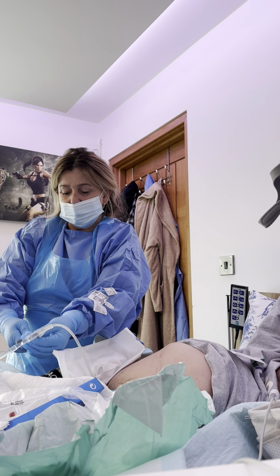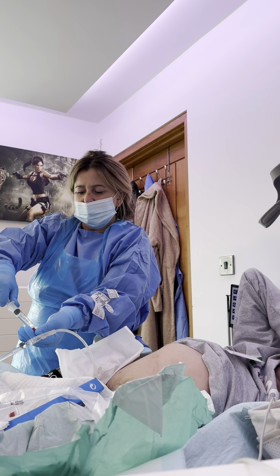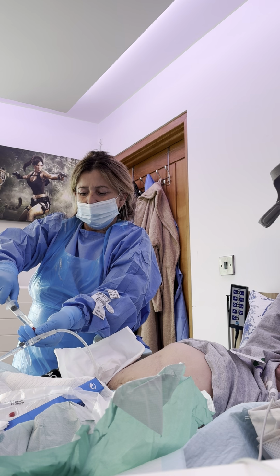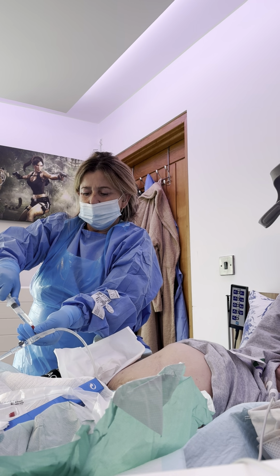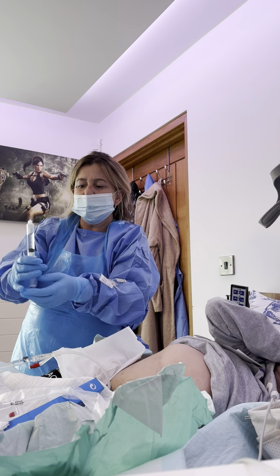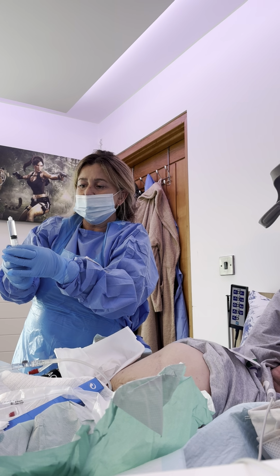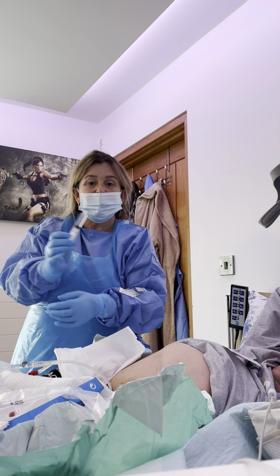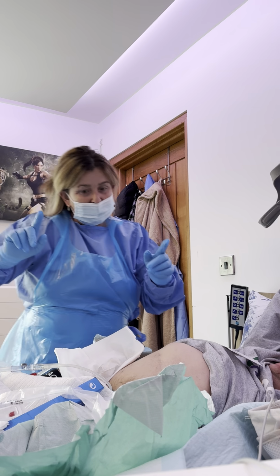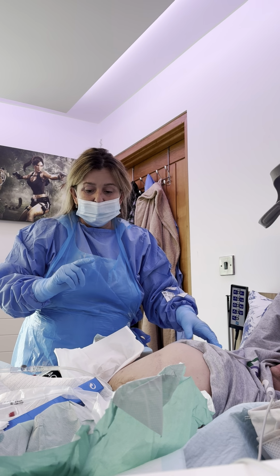He's only got 6 mils in there. When you get a resistance like this, and I've done it on previous videos, but this is an emergency, you make sure that balloon is down. Once the air bubbles are gone, then that's down. I always give it a little tap like this to check how much we have lost. 6 mils, so it should be 10 mils. So we've lost 6. However, it's been in for 10 weeks, and it would have been 10 weeks on Monday. Am I right, on Monday?